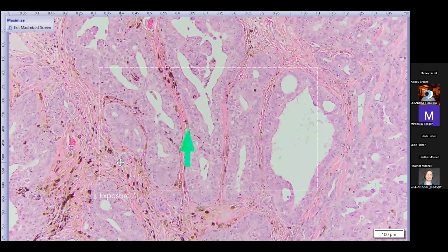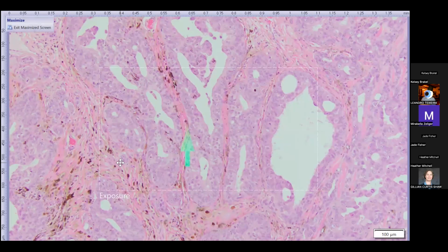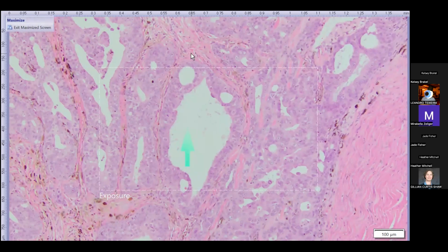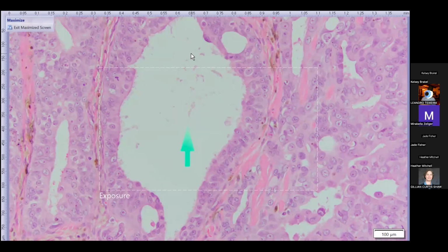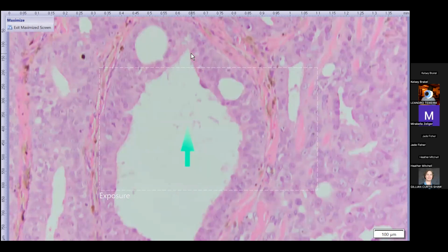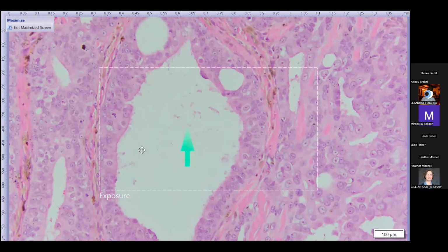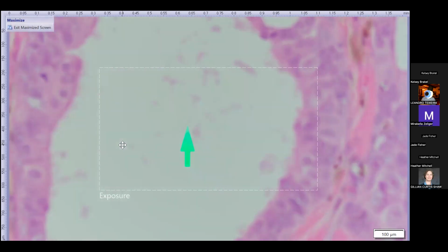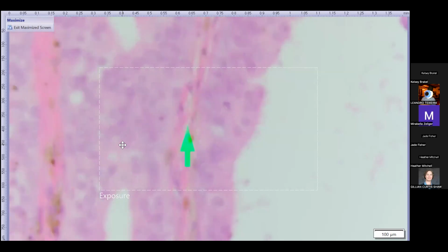Now let's look closer at who the cells are. They're epithelial cells, if you hadn't already guessed. They often form these tubules, and then they form these papilliferous projections into the tubular lumen. In particular, one of the features that I thought would make this a nice one to show, even though we recently showed a really aggressive carcinoma in a cat already, is this feature here. The lining of this tubule here is sort of pseudostratified columnar. And these cells here are exhibiting, we can actually go closer, this interesting feature where they have a brush border.